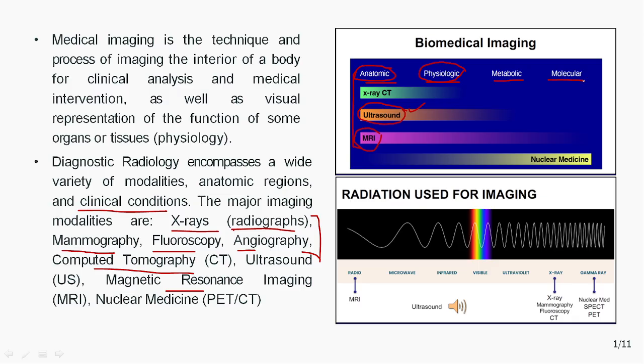And for the molecular level, we have other ways of imaging, that is nuclear medicine or PET and CT scan, PET-CT scan. So these are the different imaging technologies we are using in the medical diagnosis process.